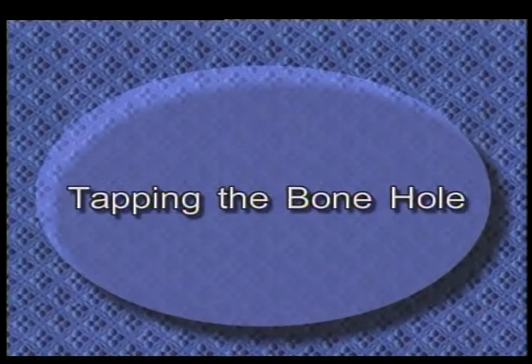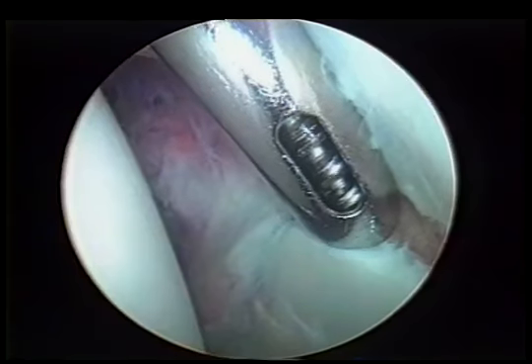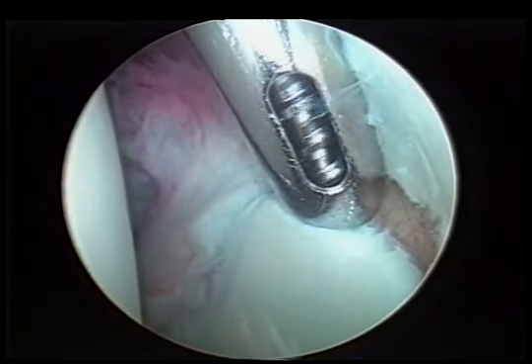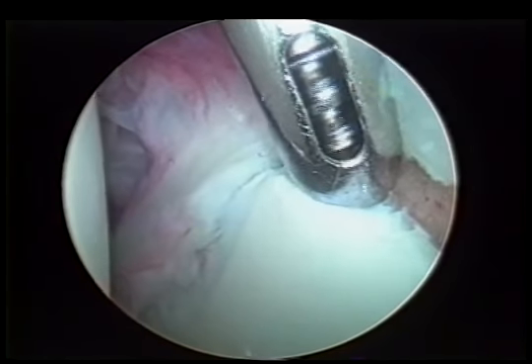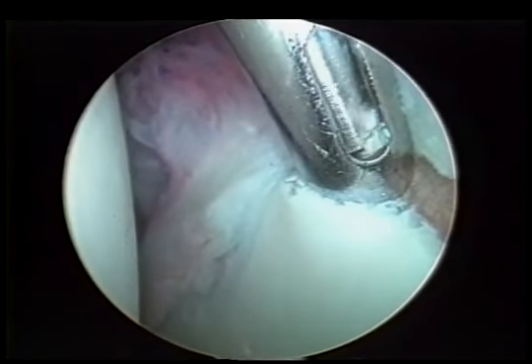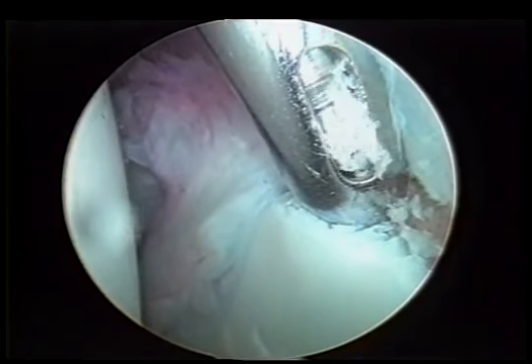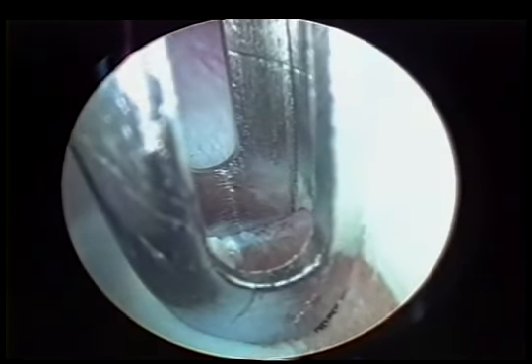Then we'll use a tap to tap the bone for the threads of our BioFastTech. There's a laser mark at the top of the threads of the tap that indicates when you've tapped to the proper depth, and then you simply unscrew the tap from the bone and you'll be ready to insert your anchor. There's our hole for the anchor.